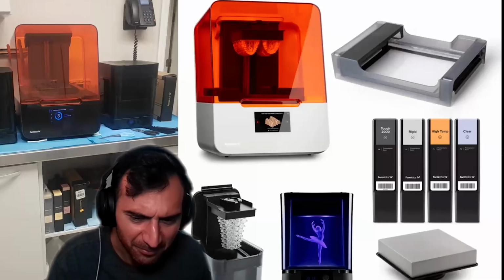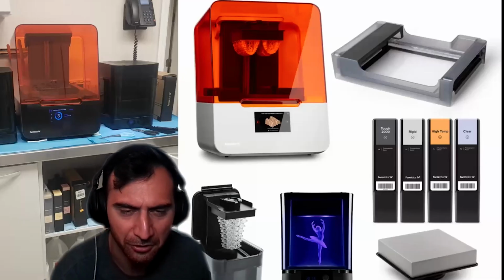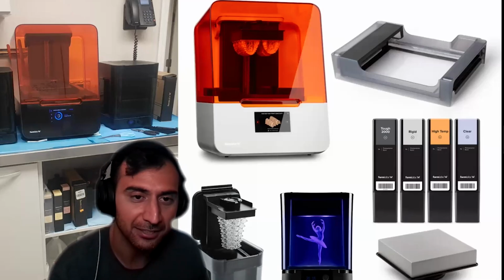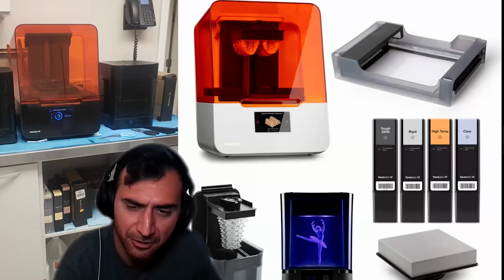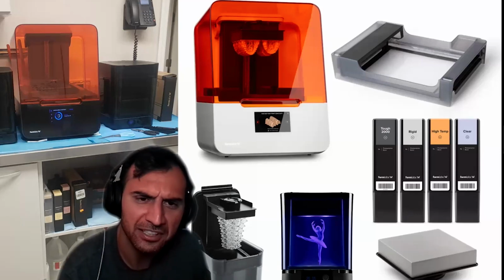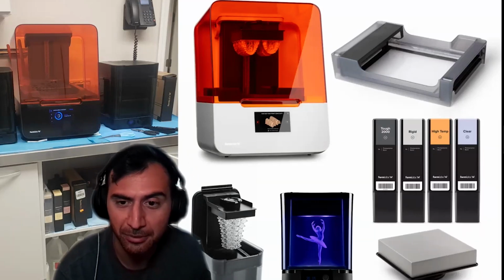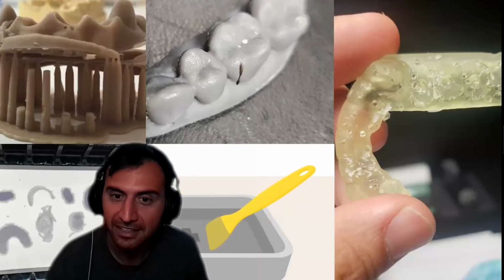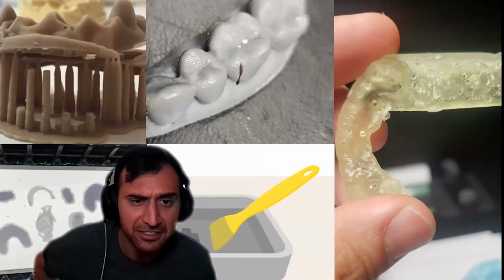Plus, it takes up some footprint. Now, granted, compared to most lab equipment, it's not the most amount of footprint. Sometimes people like to display this because it's a cool, neat little piece of technology to show off. The only thing is just be aware that it does create a little bit of resin mess when things spill or don't work properly. It can get a little messy. And again, prints can fail.